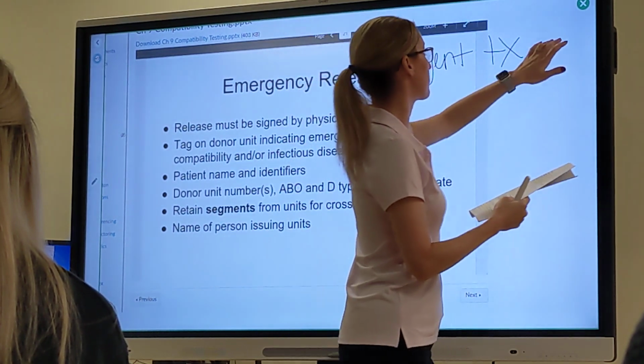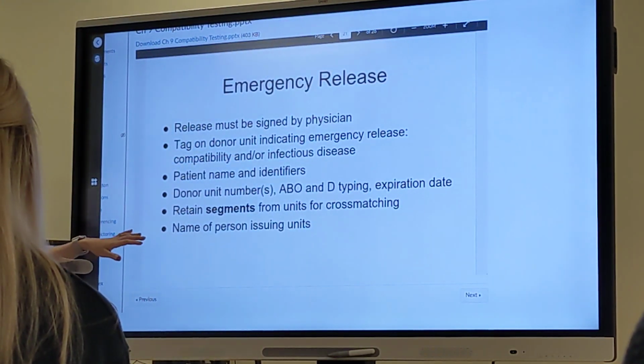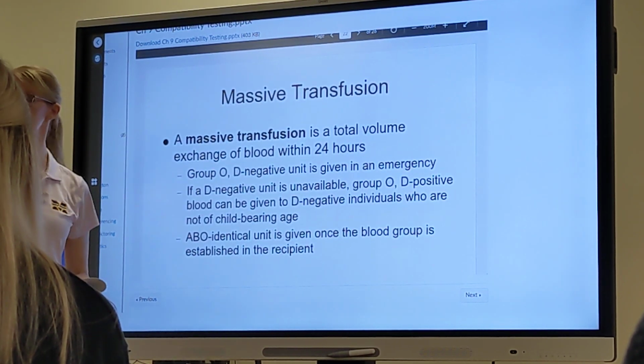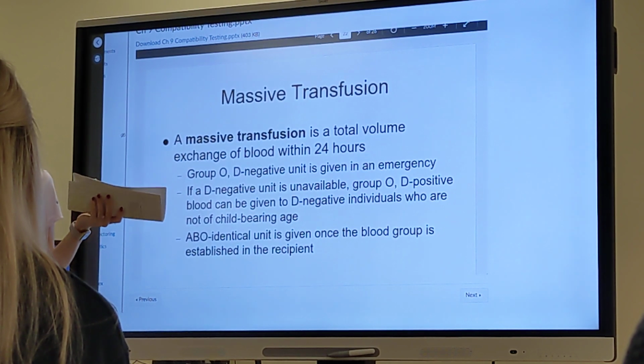So as soon as you get a specimen, you start doing the cross match and doing our ABO type. If at any time you find out that something is not compatible, call them and tell them. At that point, it probably doesn't matter, there's nothing they can do, but they can be looking out for a transfusion reaction, at least they'll know.